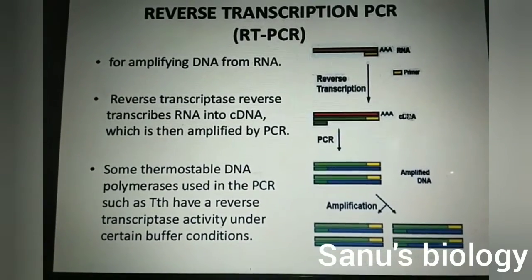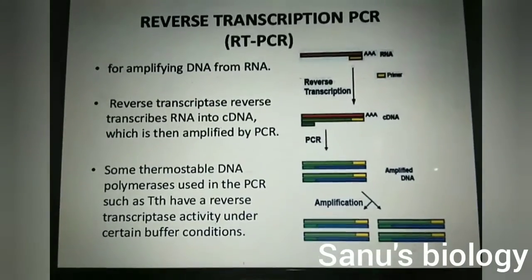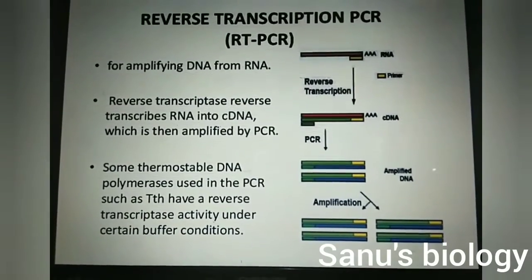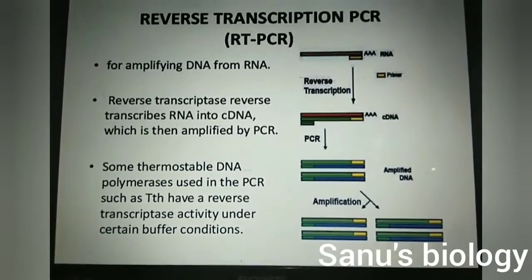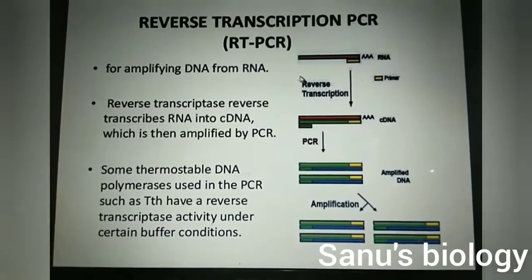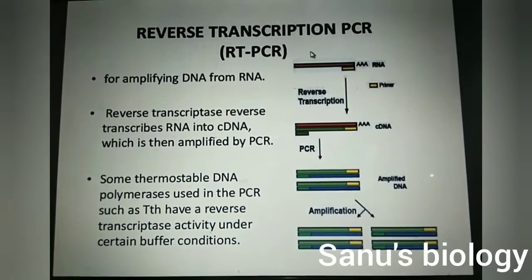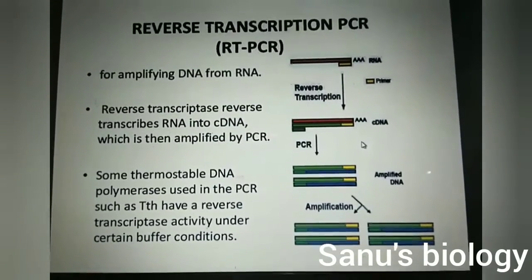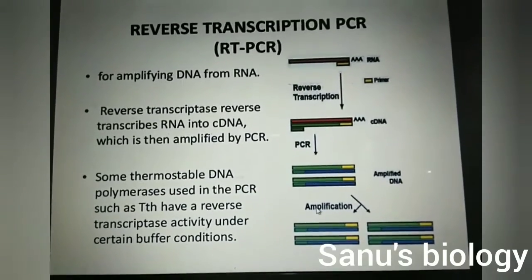Firstly, this primer is made from the known sequence of coronavirus. As we know the working principle of PCR, the double-stranded DNA or RNA gets separated, and the primer binds at the starting point and DNA polymerase makes them extended. But here we use mRNA, so the reverse transcriptase enzyme helps to get our cDNA. Now this cDNA is amplified into DNA and we get lots of DNA.